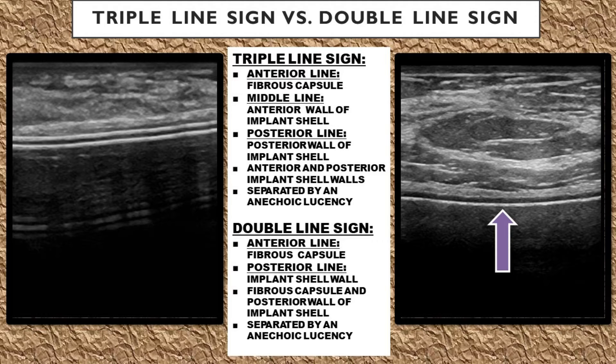The double line sign on ultrasound is for implant shells that are not as thick and are composed of a single layer. You'll see two echogenic lines: the anterior line is the fibrous capsule that the body builds around the implant, and the posterior echogenic line is the implant shell wall. The fibrous capsule and the posterior wall of the implant shell are separated by an anechoic space called the lucency.